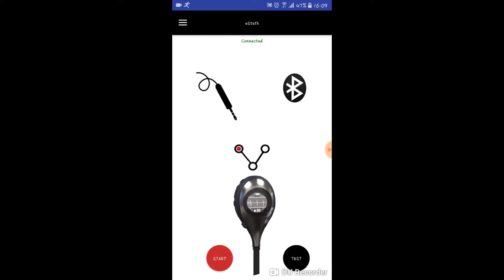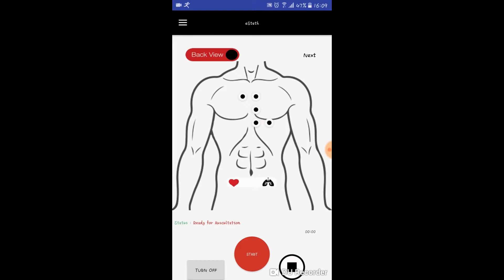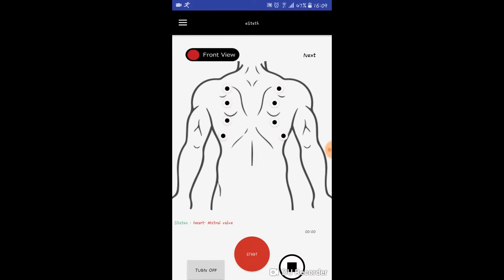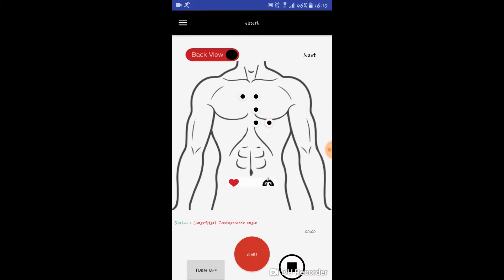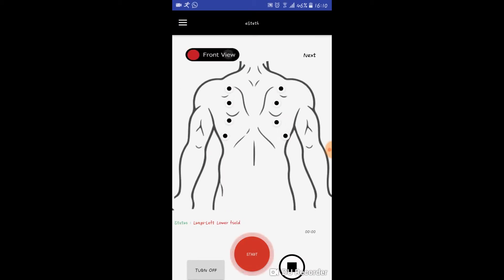Then you simply have to click on start. You have an option to select different valves in the front side of the body, whereas in the back view you can select different angles while your heartbeat is being recorded.